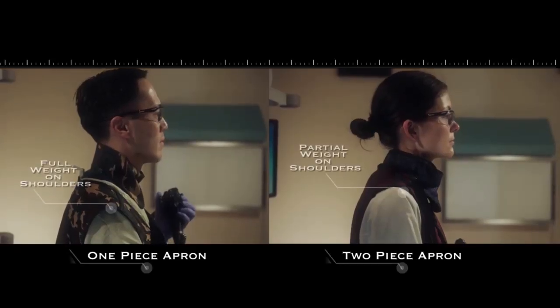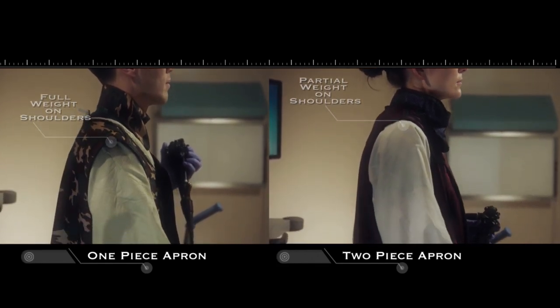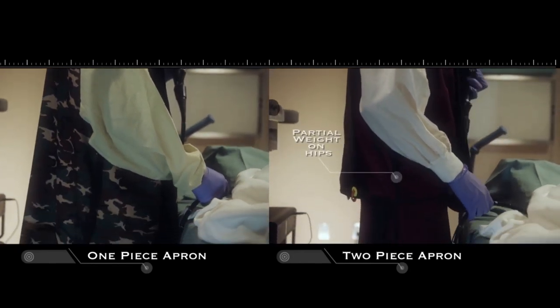When possible, lead aprons for procedures that require fluoroscopy should be two-piece aprons, which transfer some of the weight of the apron from the shoulders to the hips and reduce upper body strain. Optimizing the room for these procedures is even more important, given the extra weight of the lead on the body and the multiple screens often used for the procedure.